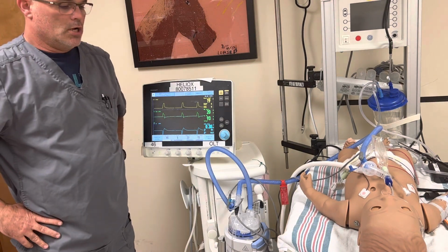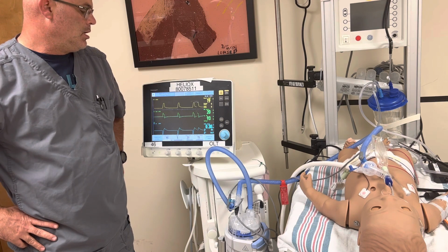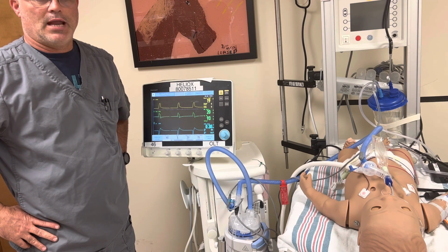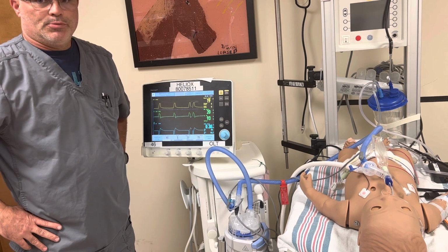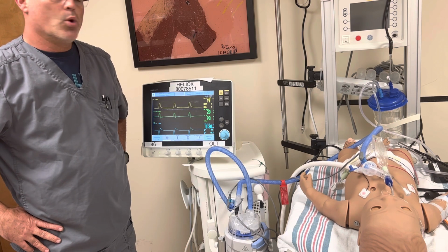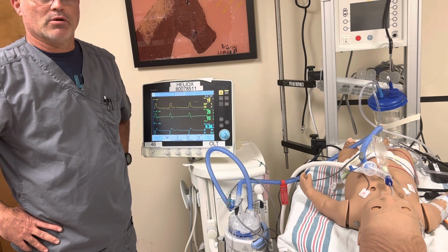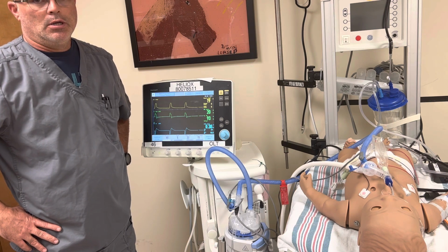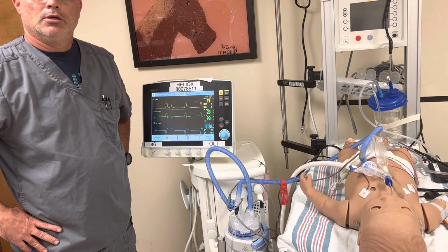Okay, so what we're going to talk about is how do we initiate our vent on our patients here, and what is involved in settings that don't have specific orders attached to them. So, in order to put a vent on a patient, there's minimal ordered settings that have to be done by the physician. One being you have to have a peak airway pressure or a volume order, a PEEP order, a rate order, and a FiO2 or a keep stats greater order in order to initiate the mode on a patient.